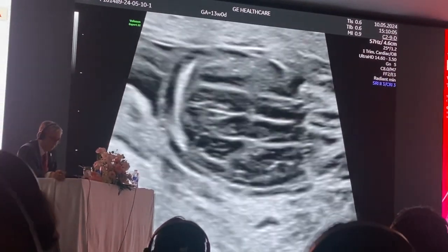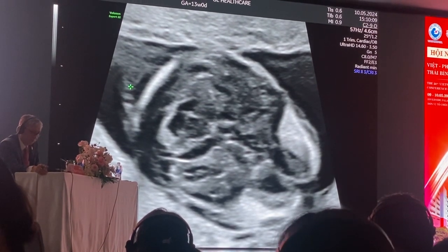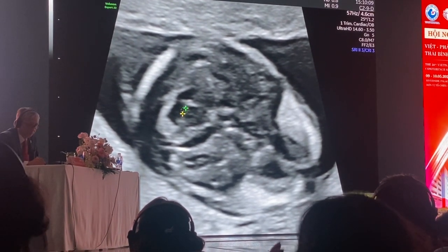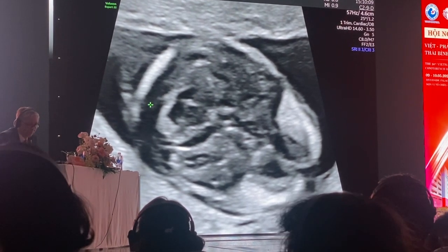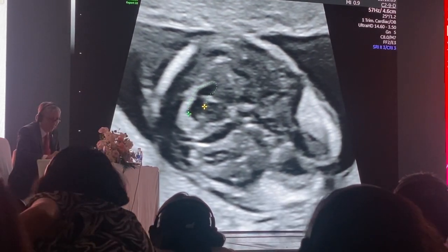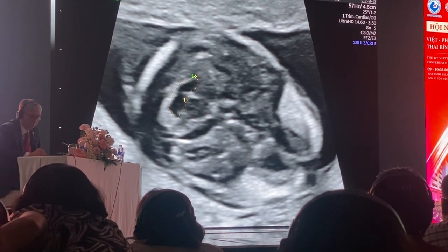And then the fourth ventricle, to show you the fourth ventricle. So this is the fourth ventricle. If I draw you a generic area, this is the area of the fourth ventricle, generic trace, area trace. The advantage of looking at the fourth ventricle in this section is that it shows you the full area of the fourth ventricle. But when you do it sagittally, you only see just a tiny section of it.